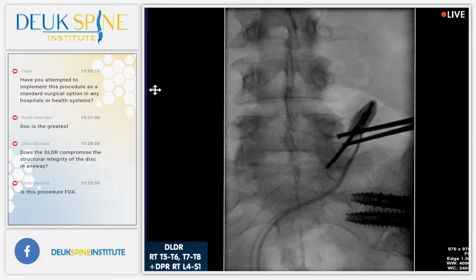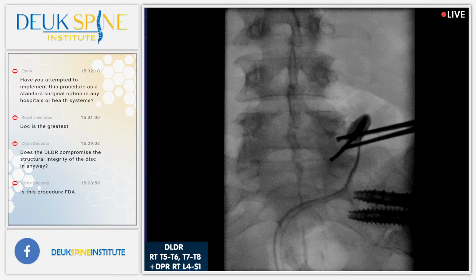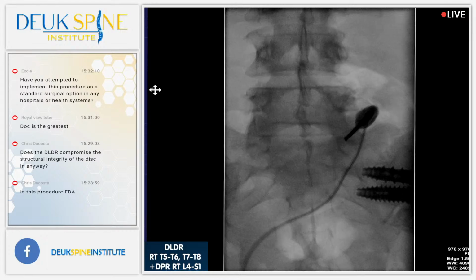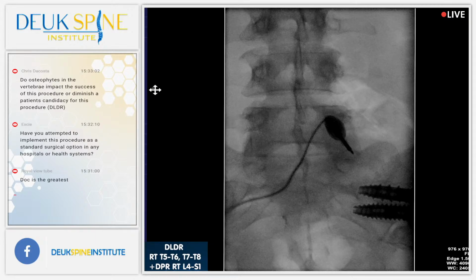Too medial. Shot. It's almost good. Shot. That feels better. Nope. Still not good enough. Shot. Too medial. Hey, watch the scope there. Shot. All right, let's see. Shot. Nope, too medial. Shot. Shot. That's really nice, actually.